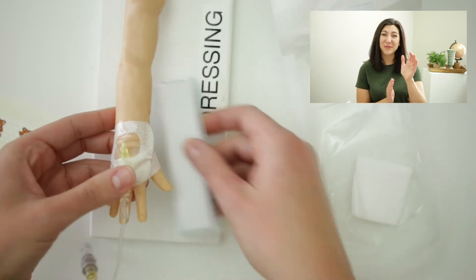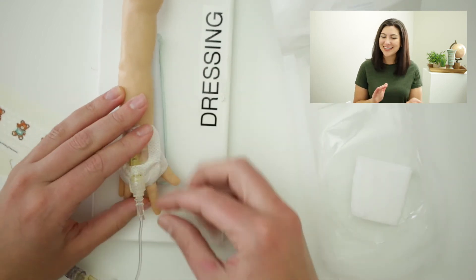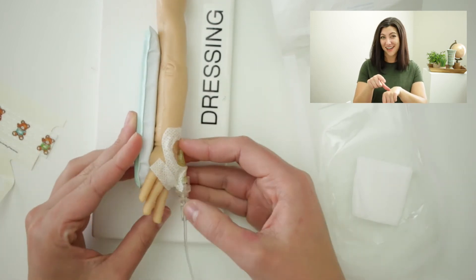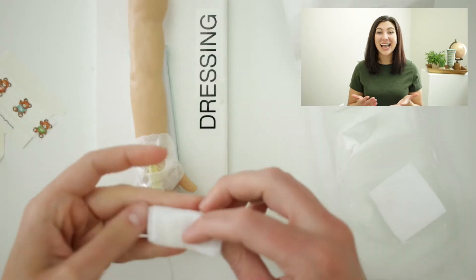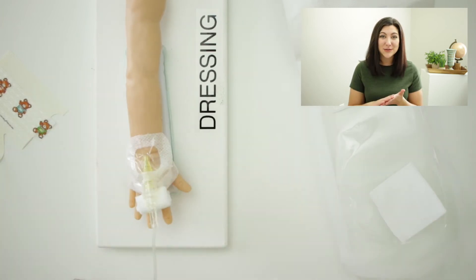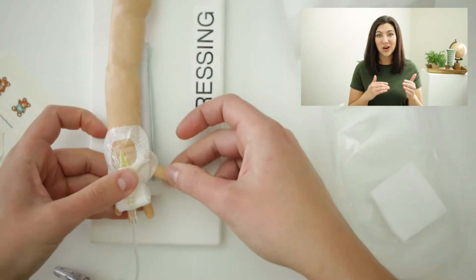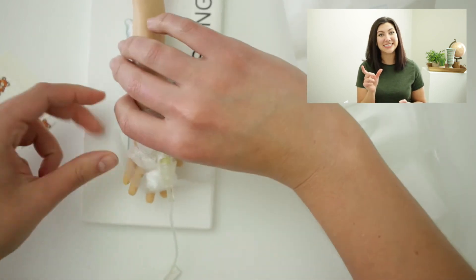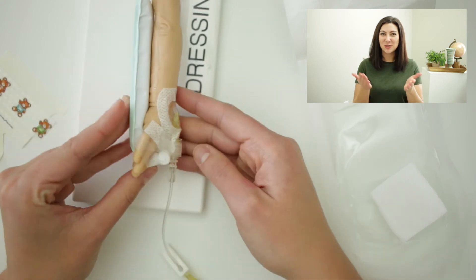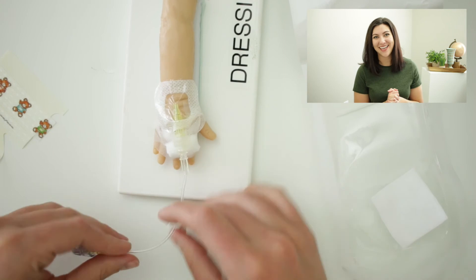Now we're going to go ahead and put the arm board underneath our patient. In real life, as soon as that arm board is on their hand, they'll probably wrap their fingers and thumb around it. If you turn the IV to the side, you can see that on this really tiny little guy, most of the hub of the IV where the extension piece connects is hanging off the IV, which can catch on different things and pull on that IV — and the hub can put a lot of pressure on their knuckles and fingers. To fix this, I typically take a small piece of gauze or two-by-two, fold it up a few times, and place it right underneath the hub to provide a nice barrier for their skin and help prevent catching. I'll then take a longer piece of adhesive tape and wrap it around the front of the IV to provide support, wrapping around to the underside of the IV.